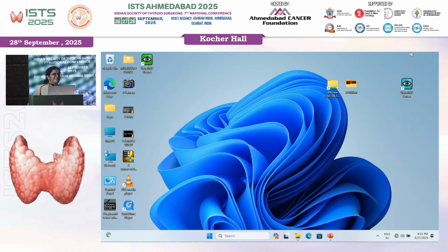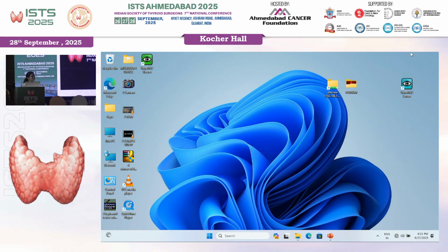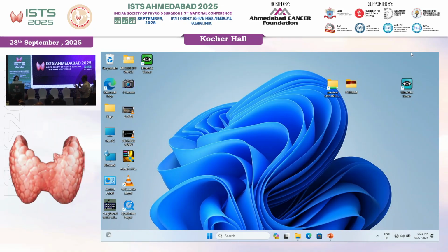Thank you. It was a great presentation. Definitely. Not questions, but one or two comments. In TIRADS 4 and TIRADS 5, there is a size criteria to guide for the FNAC. But I just wanted to clarify, and you may agree with me, that if there are multiple TIRADS 4, TIRADS 5 nodules in both the lobes, even going out of the size criteria, you will try to FNAC them because there is multi-nodularity in that. So the chances of malignancy increase, and the chances for the surgeon to operate on that thyroid increase.